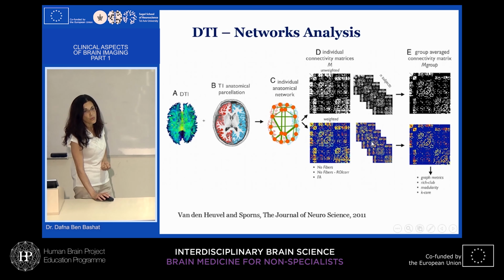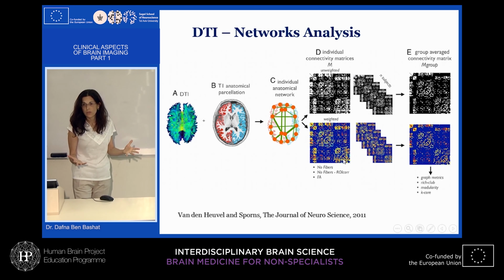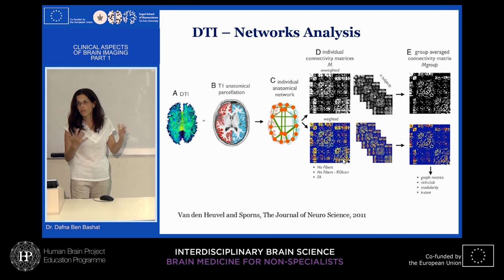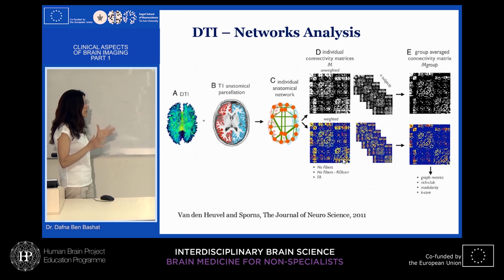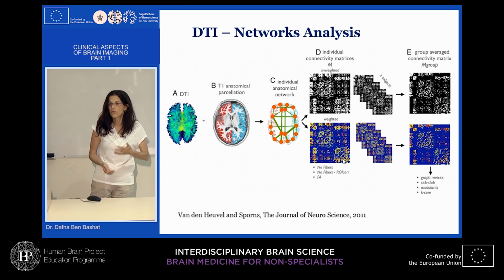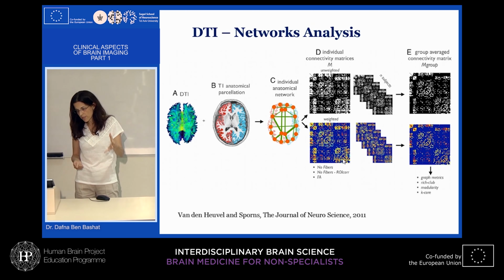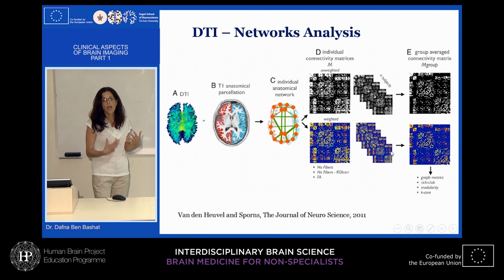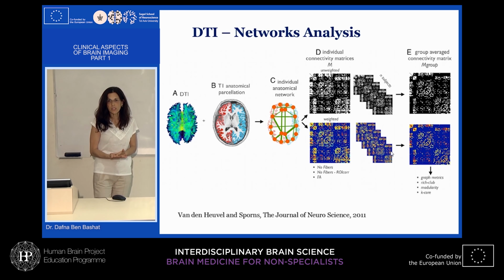Then we can take two groups, either healthy, longitudinal, or before and after therapy, a group of patients with ALS, age-matched control, schizophrenia, compulsive disorders, whatever we want to study, and then make a specific or any statistical comparison between them and learn within these matrices where the differences between groups are.